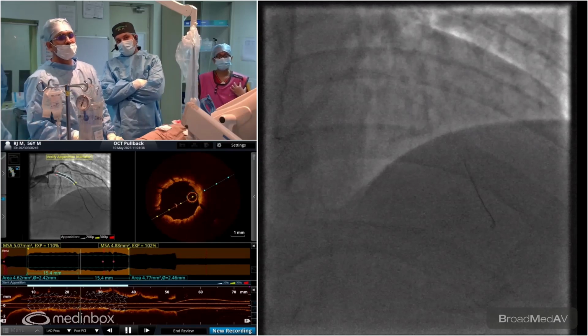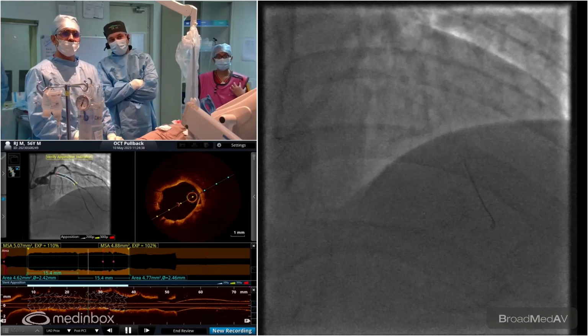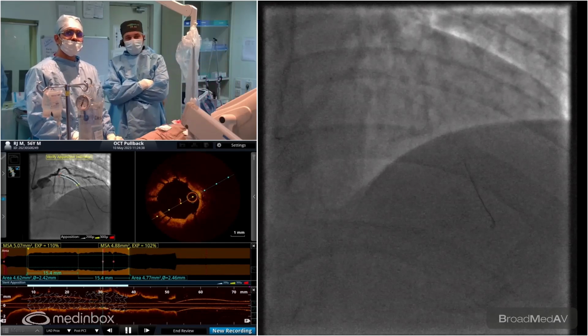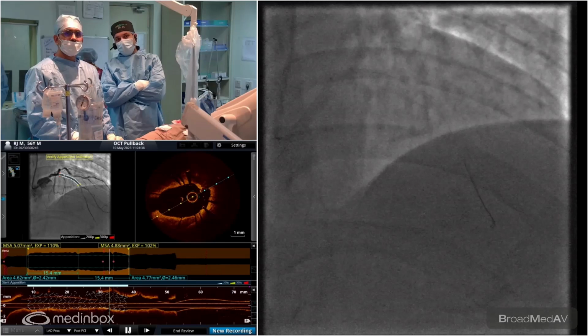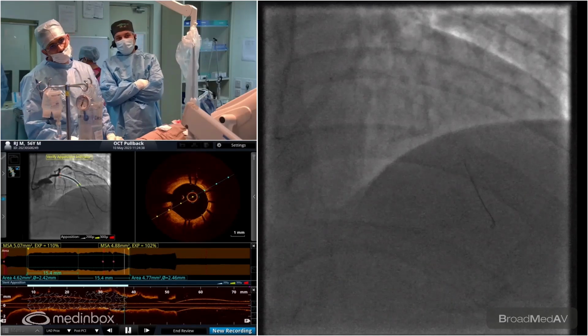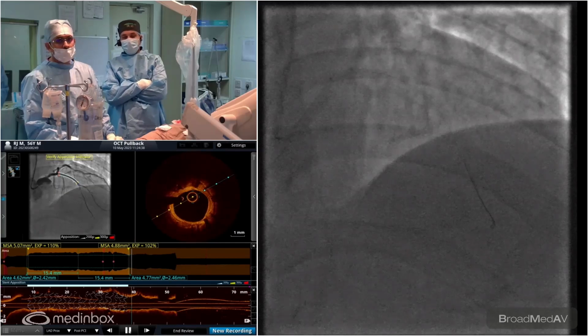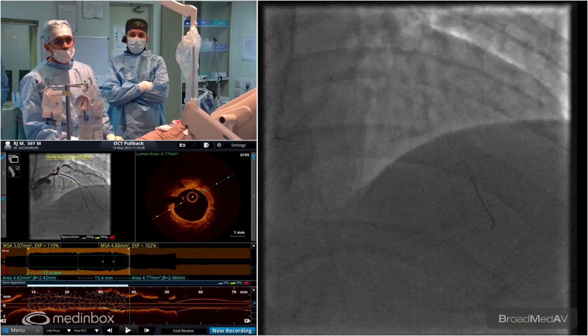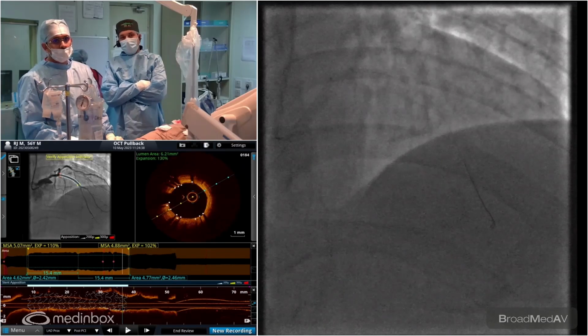there's some sort of little tissue prolapse, but ideally I won't do anything to this tissue prolapse because it doesn't affect the TIMI flow as well. Over here, there was a diagonal branch. That's the reason you notice some malapposition. And coming, this is the overlap segment with the previous stent. Could you freeze that, please? Come back. Yeah. This is the overlap segment with the prior stent.